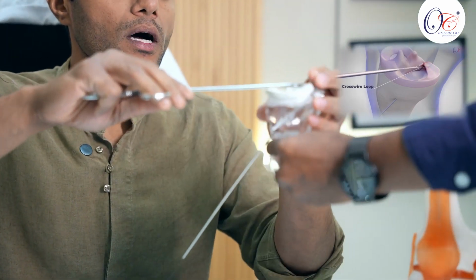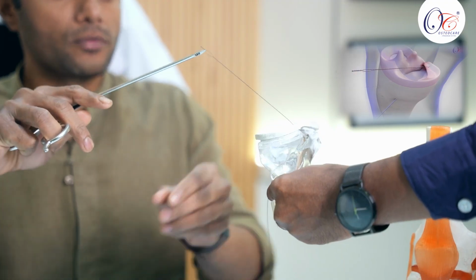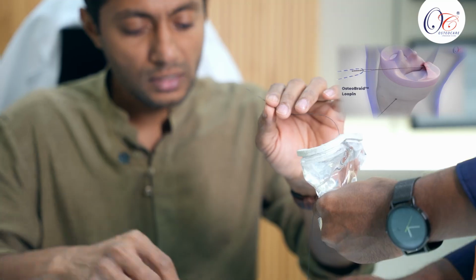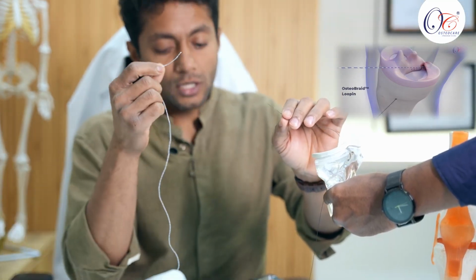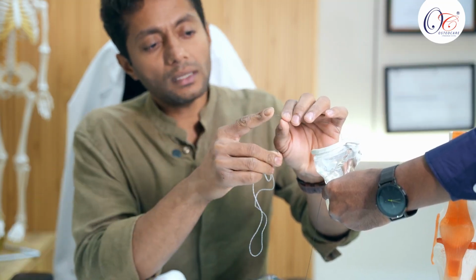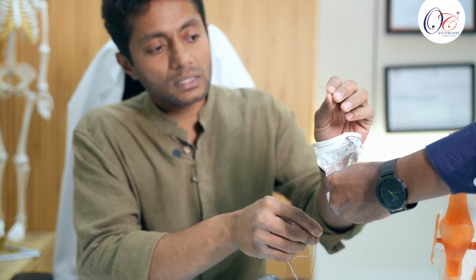So once we get this loop inside the joint, we try to pull this loop out using a suture retriever and then we remove it. So once the suture retriever is out of the portal, we use this Loopin fiber and we shuttle it through the tibial tunnel. So why did we use this Loopin fiber? We found that the metal loop many times can break when we pull the anchor. So once it breaks, again we have to go through all the process once again.